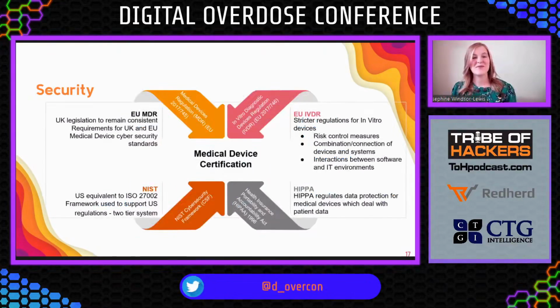Besides the point, this is also a medical device. Medical software counts as a medical device in most countries around the world, and therefore it needs to pass medical device certification standards. These vary around the world. Up here, I've put four basic laws from the UK, EU, and the US. In order for a medical device to be made available in a country, it has to be certified.